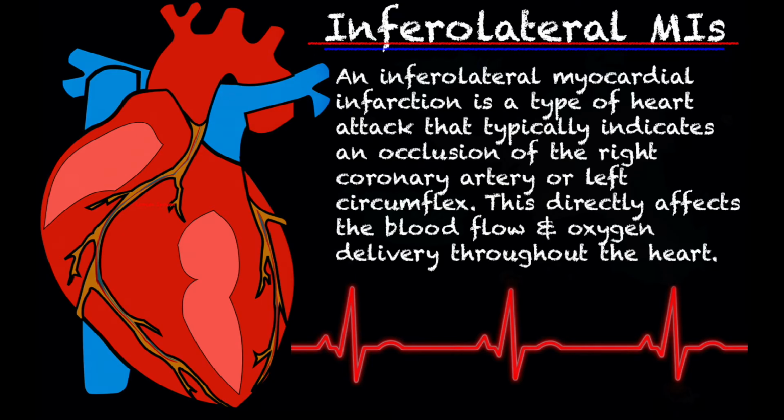So let's talk about what an inferolateral actually is. Inferolateral is such a weird word because it comes from inferior and lateral. And to me, I feel like it should be inferiolateral, but I didn't make up the rules.